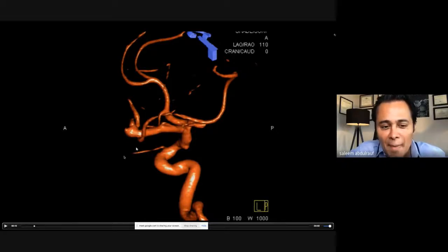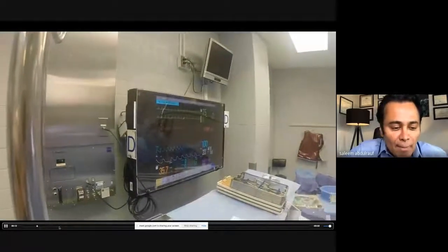This is different from a basilar tip aneurysm. This is the best treatment for this aneurysm today, with the best technology of endovascular available, is microsurgical clipping in the middle cerebral artery territory. Okay. So let me show you.